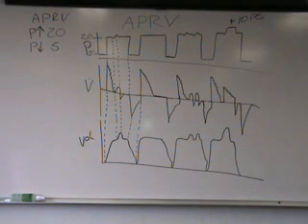And if it's set up correctly, the P high time will be a lot longer than the P low time, because that's what we're currently using this mode of ventilation for. We're using it for a lung protective strategy.